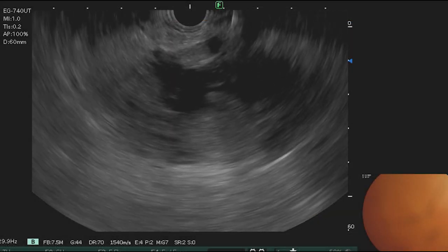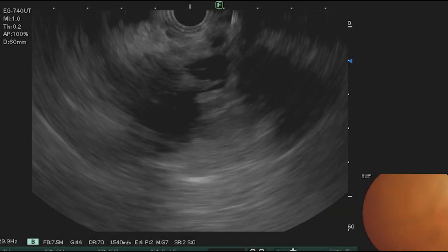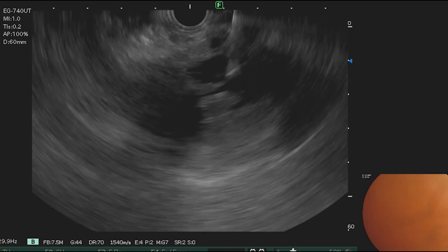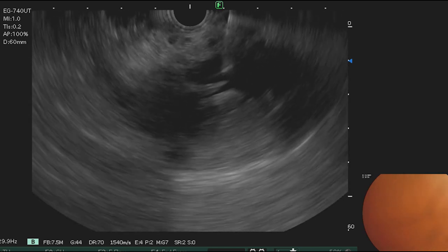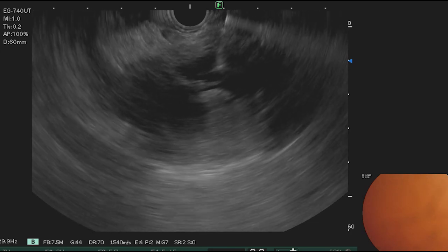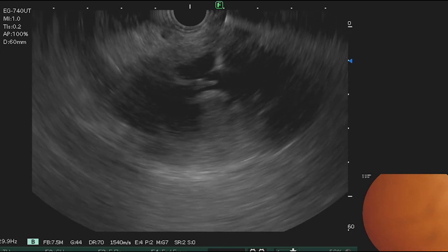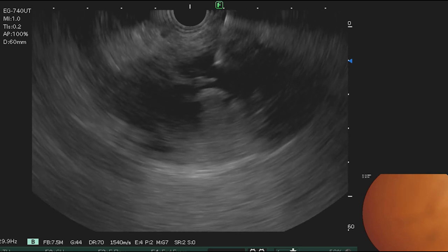Considering the lesion as a cyst, a 19-gauge needle should be the preferred route to execute FNB. However, according to the location in the second duodenum, the prominent solid component, and the small amount of liquid, we modified our approach using a 22-gauge cutting tip needle.